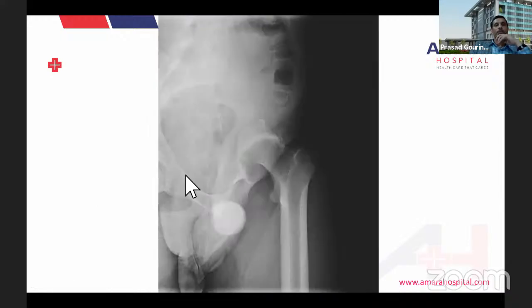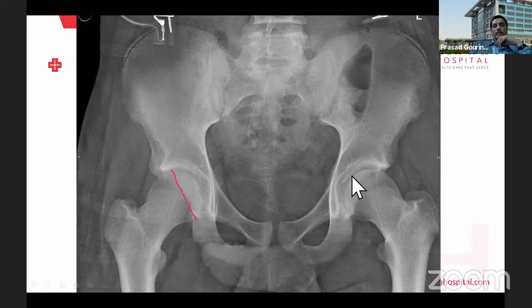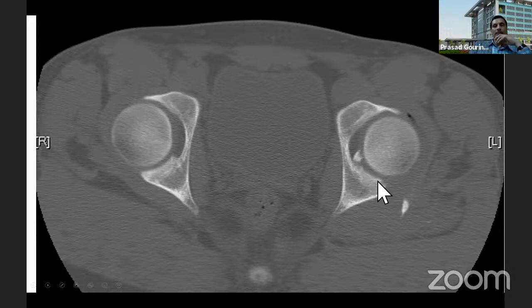Here's a case example. 15-year-old, closed triradiate cartilage, small little wall piece, posterior dislocation, reduced reasonably well, congruent it looked like on this X-ray. Look at the opposite side, there's a crossover sign, there's a retroverted acetabulum with anterior overcoverage. So that's his posterior wall on the injured side. Very deficient, normally it's 50%, very deficient. And this piece is making you more deficient, the posterior wall piece. Small piece, but significant. That's an anterior wall, anterior coverage. So he has predisposition to impingement that probably levered the head out with low energy. And he also has a cam morphology. The round head, bone is outside the sphere, the cam morphology. Again, decreased internal rotation. This patient also had a loose fragment in the joint that I didn't pick up on X-ray. So it's a regular CT scan of the pelvis.